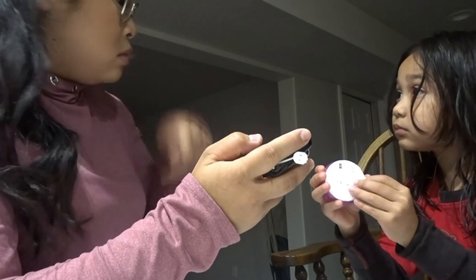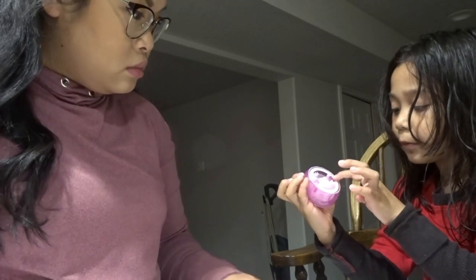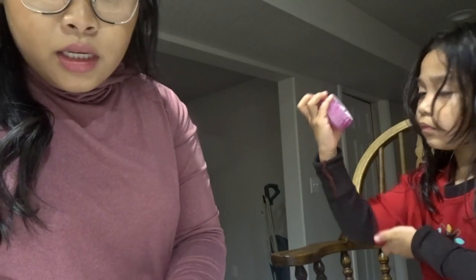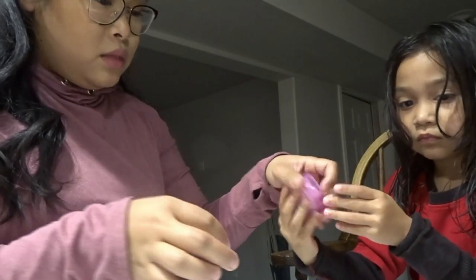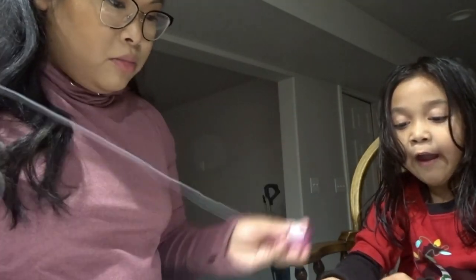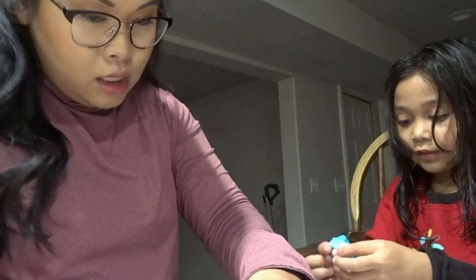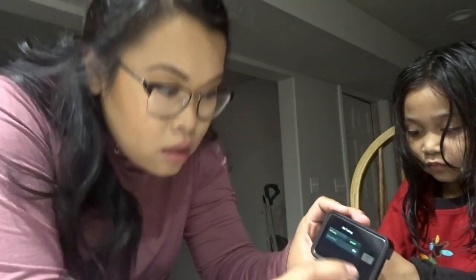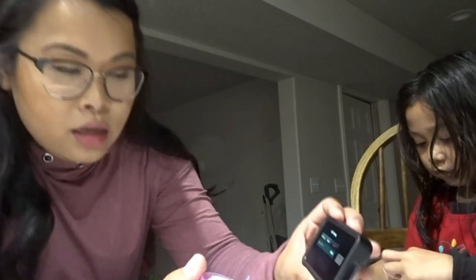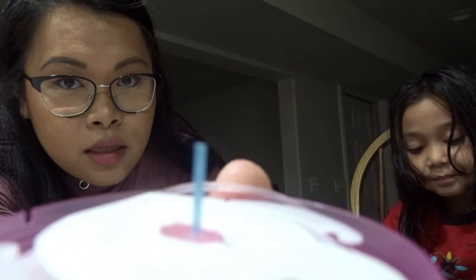We removed the old cartridge and put the new cartridge in - now it's going to detect the insulin inside. We're going to cap the needle so nobody gets poked. Now we need to fill the tubing - we'll do that once we're ready to put it on. Emma uses Humalog as her insulin. Connect the two pieces and twist it tight, then press Start to fill the tubing. It usually takes about 12 units - wait for that bubble of insulin to appear right on the blue tip.